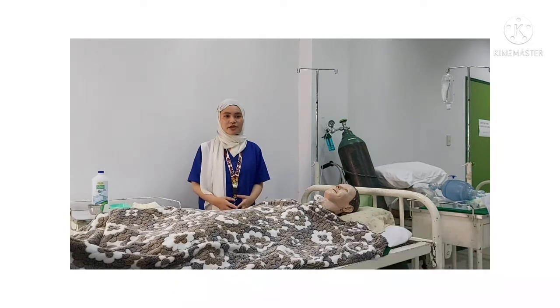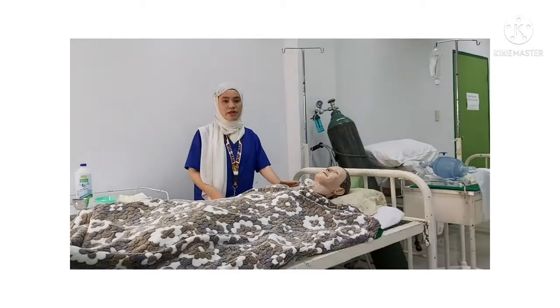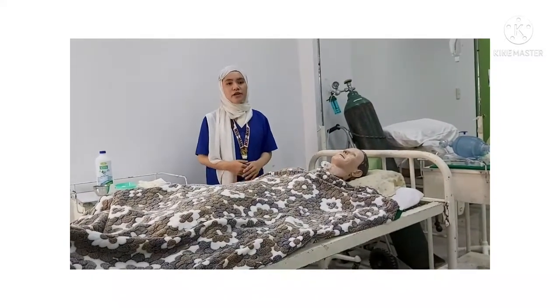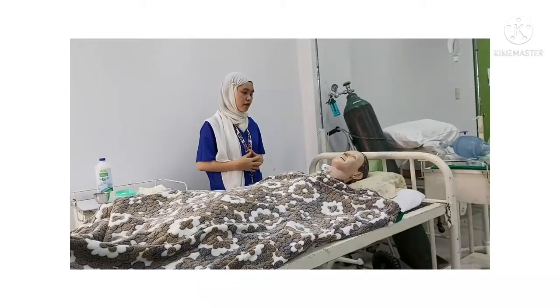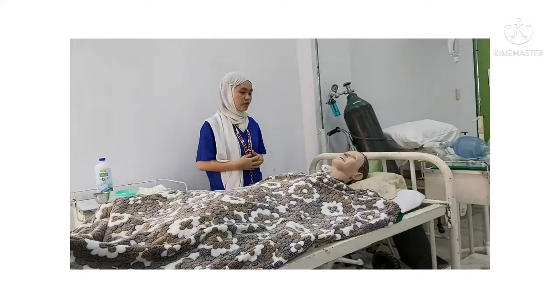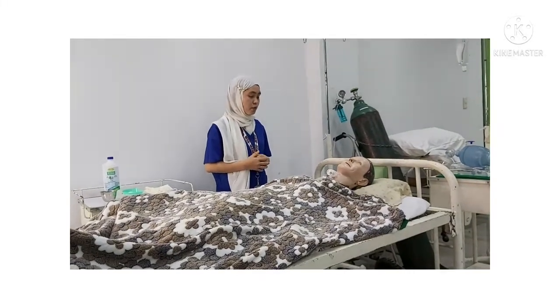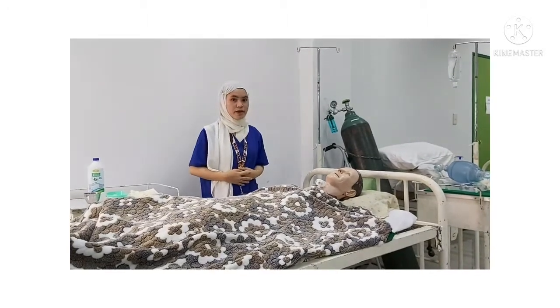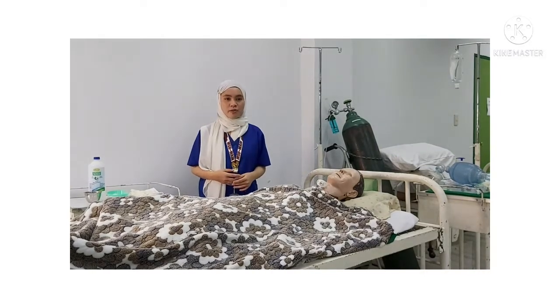First, determine the need for suctioning. This is to assess for clinical signs. Now explain the procedure to the patient. So, sir, I am Siti Bashma Demorin, and I'm your nurse for today. And I'm going to suction your airway. Is it okay with you? This decreases anxiety and facilitates cooperation.